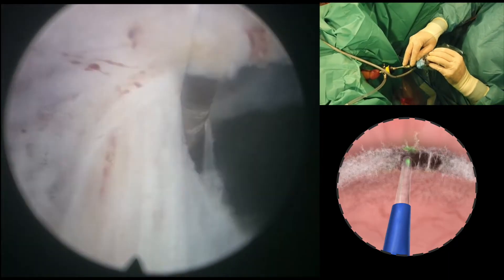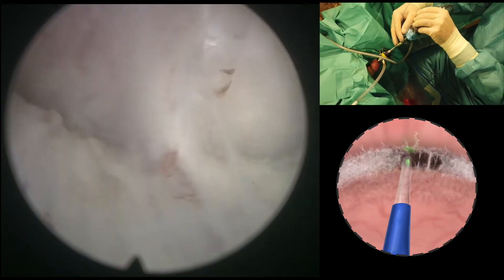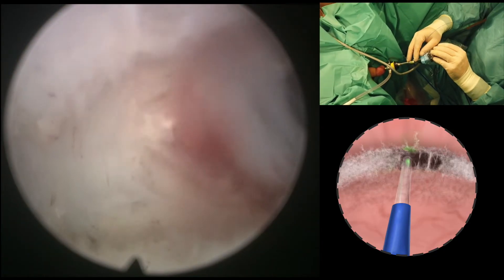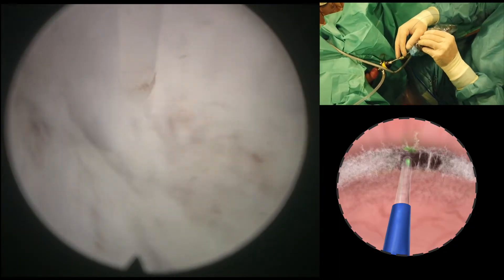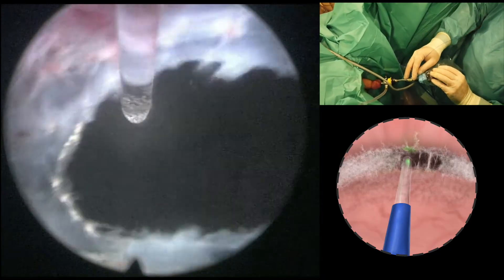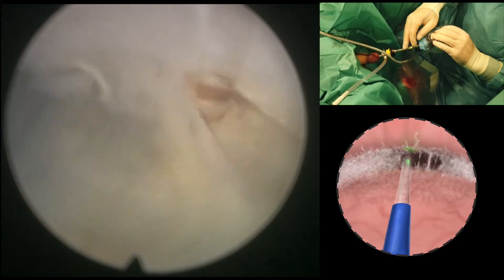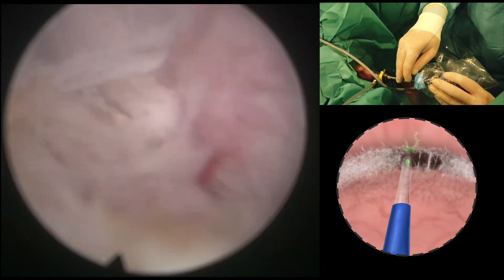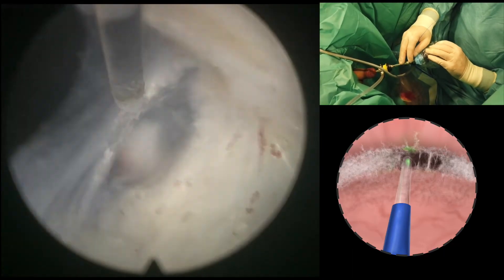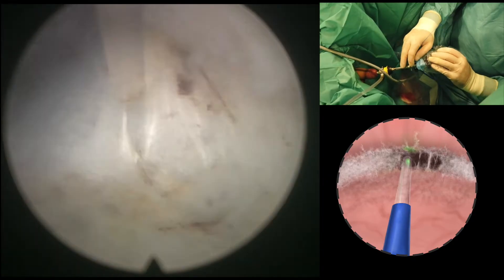These are the vertical fibers of the bladder neck — it's a pathognomonic sign that if we cut there we're going to enter the bladder above the anterior commissure. This is the mucosa of the bladder; there are many vessels at this level so we have to be careful because there is a lot of mucosal bleeding. This is the circumferential cutting of the bladder neck following the anatomical planes.